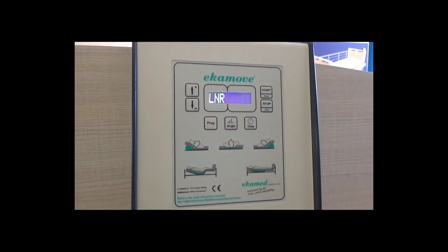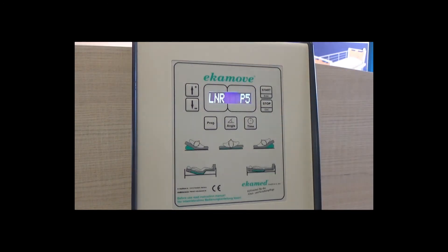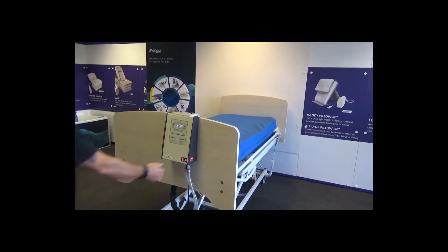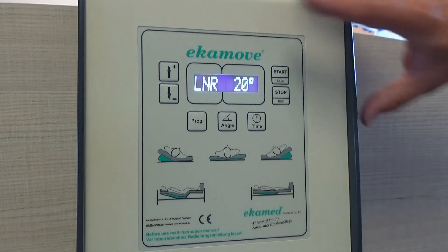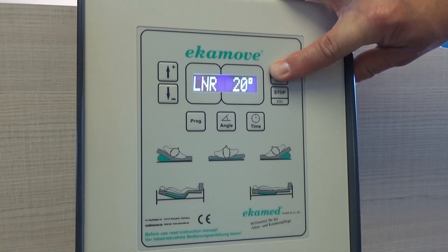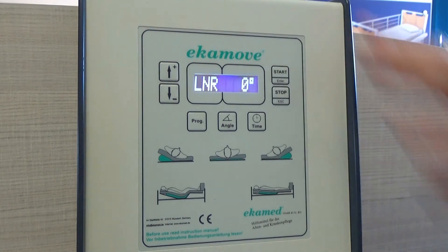Once selections are made, press stop. The system is now ready to use. Press start and you will hear a series of clicks. As the air chambers begin to inflate, the screen will first show the angle that is being achieved. Do not worry if at first the screen shows a minus angle degree — it will soon adjust and you will see the system beginning to inflate and rise. Once the desired angle has been achieved, the screen will show the dwell time remaining.